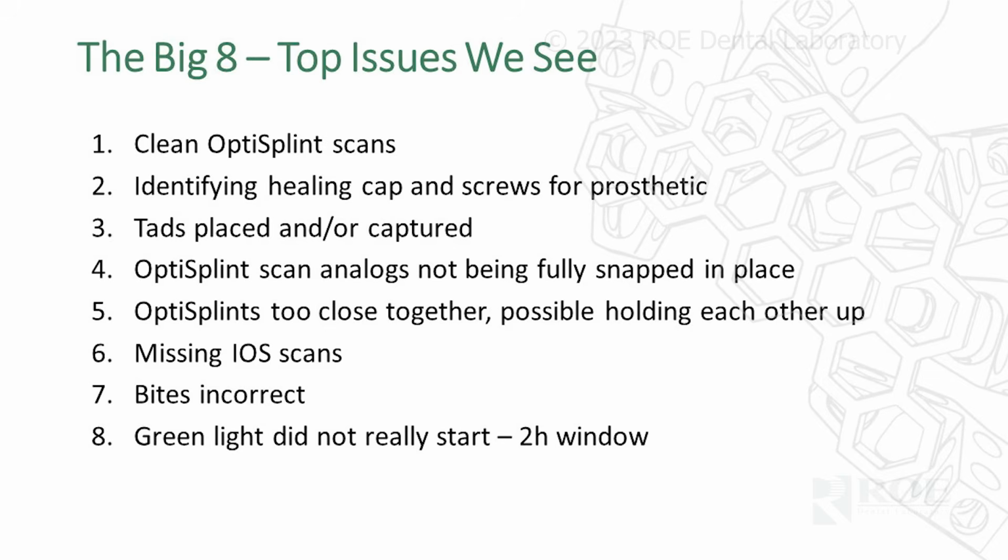Healing caps. Be sure to tell us which healing cap you're using. We want the brand, and if it's not in our drop-down list, then we need to either work with that company or you need to physically send us one of those healing caps for us to measure, right? Otherwise, we're mounting the case digitally wrong, and we've had that happen, and it is not a fun day at all. All right, so that's very important.